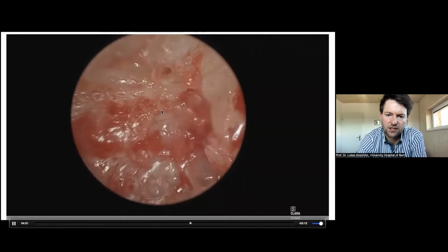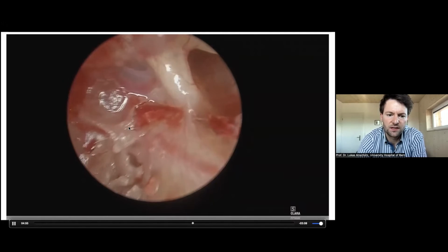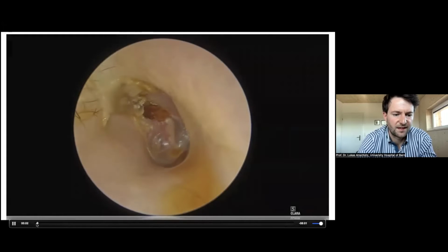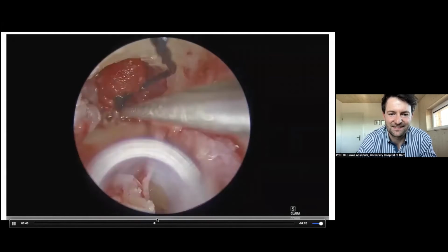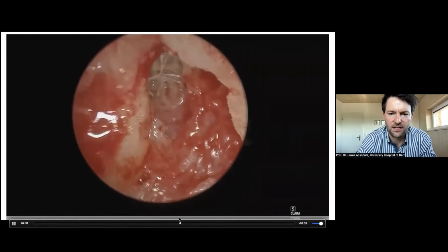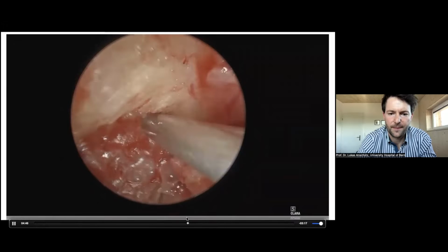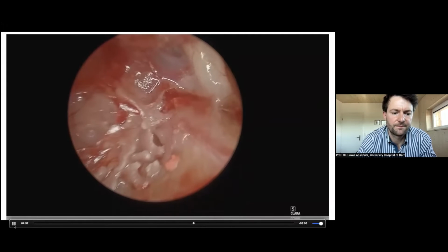And we can then check again inside the situation. You can see here, oops. Sorry. We can look at the film again. I just wanted to show you this. It is quite short only. Visible. Yes, you can see here.